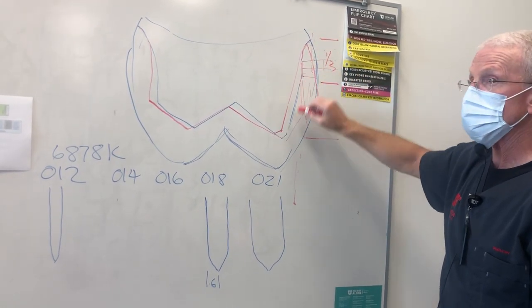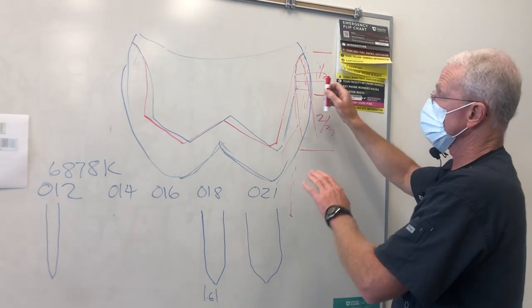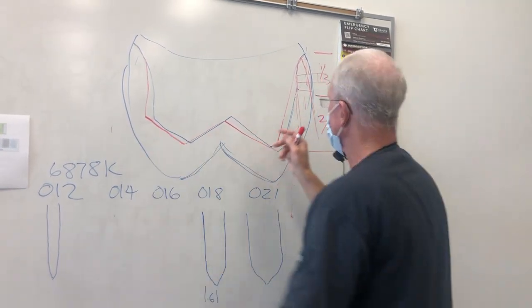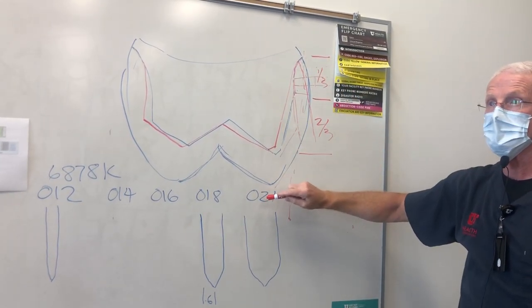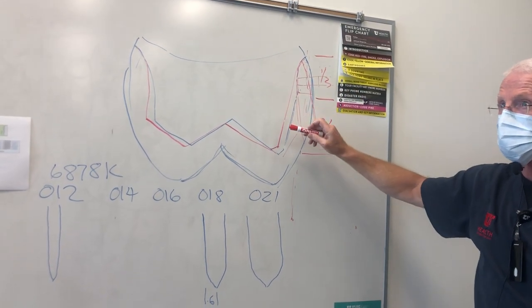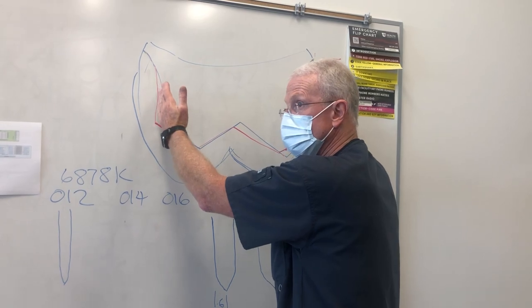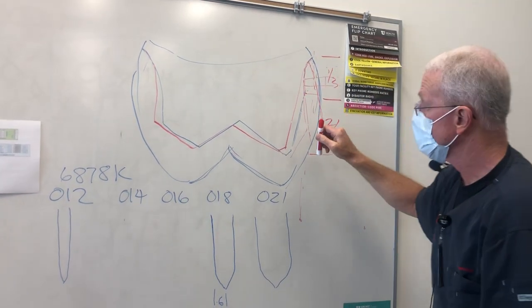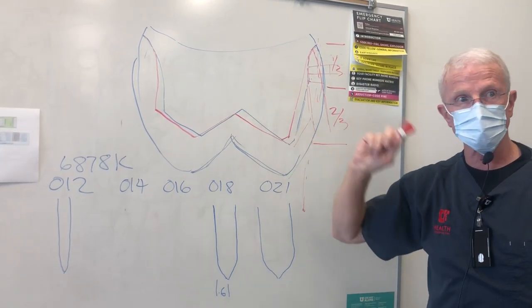If you don't do two-plane facial reduction, it forces you to either move your axis to the lingual or to over-taper your preparation. If you do the two-plane facial reduction, you maintain more resistance and retention form in your preparation, and you allow for the thickness of your restorative material.